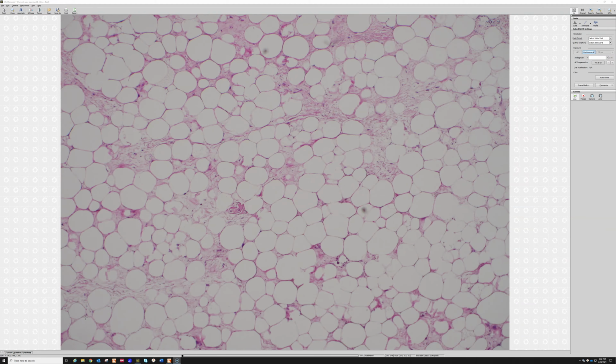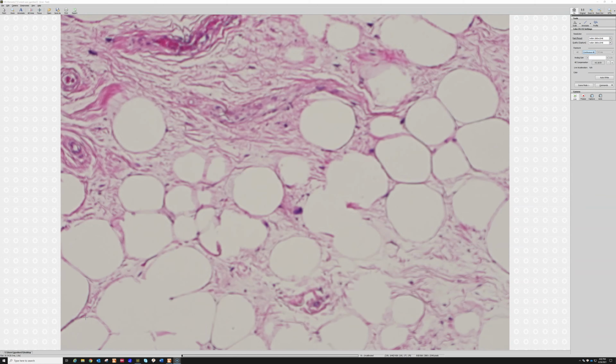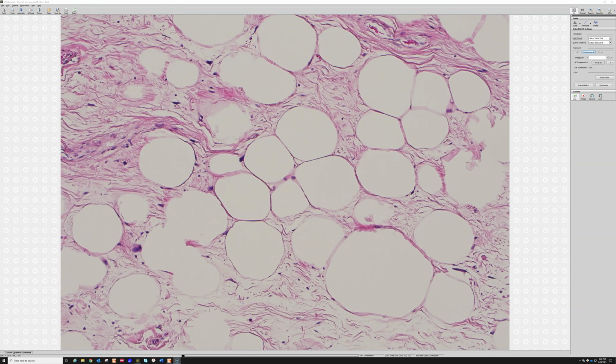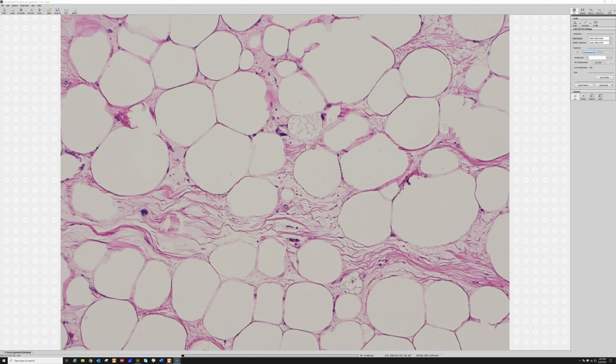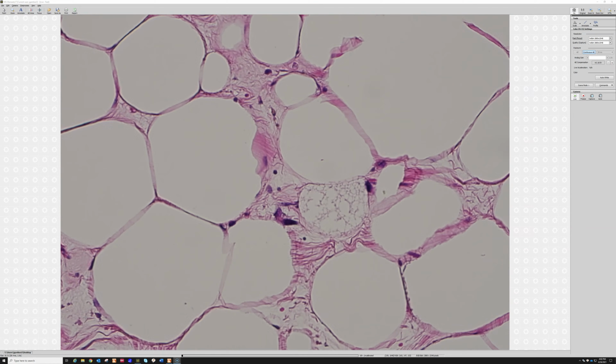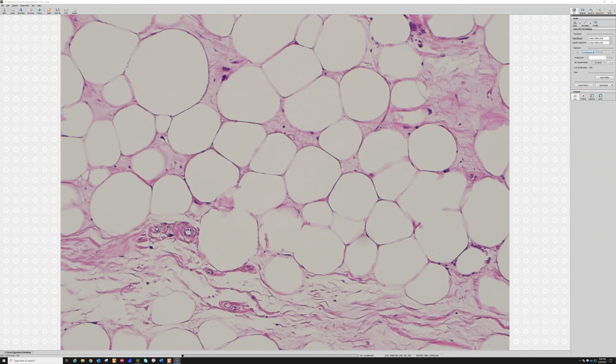Now, one thing you may notice I did not talk to you about yet is lipoblasts. And that's because lipoblasts, although they may be seen in well-diff liposarcoma, are not required for the diagnosis. If you have the features I just showed you, that's the characteristic feature, the big atypical pleomorphic cells. That's the key cell that you want to find to point you towards well-diff liposarcoma, these hyperchromatic guys here. There are, right there, scattered lipoblasts in this case. You can't really see a pleomorphic nucleus very well. It's kind of crunched on the side, but you can definitely see vacuolated, multi-vacuolated, clear lipid-filled vacuoles in the cytoplasm.